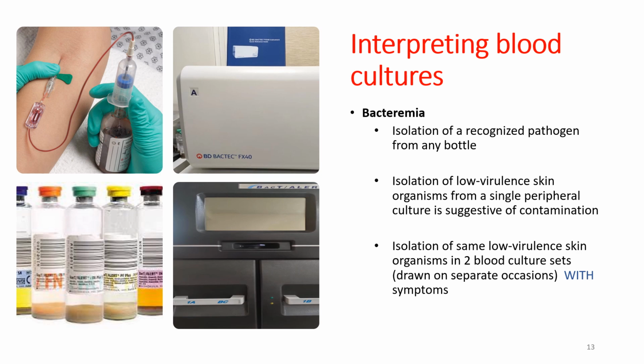Before I move to the details of the colony count, let us understand blood cultures. We do blood cultures for diagnosis of sepsis. But for a correct, rational way of doing a blood culture, two sets of blood cultures need to be collected: one set from the left hand, one set from the right hand, and each set should consist of one aerobic bottle and one anaerobic bottle.